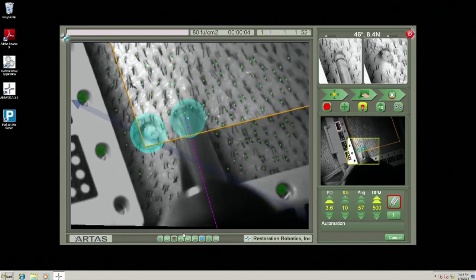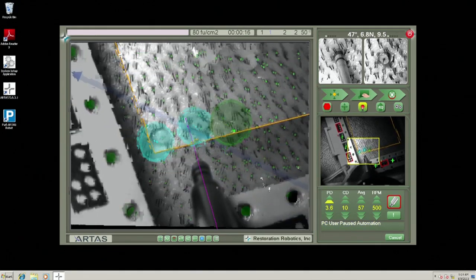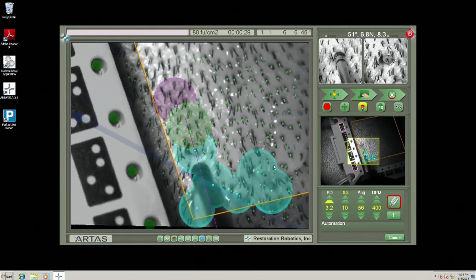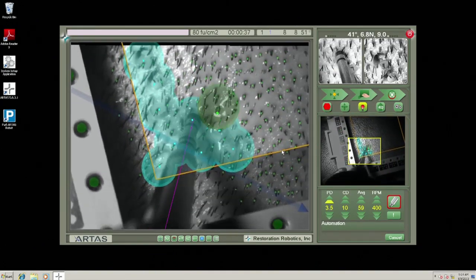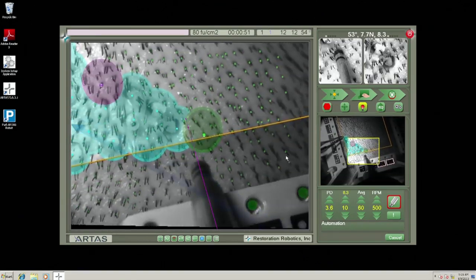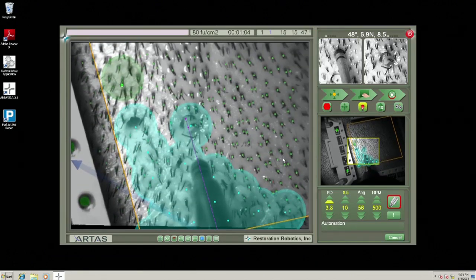It's beginning to harvest. This is great. We are beginning to harvest. I'm going to be changing a few things about my settings, just the diameters of the different harvest attempts. We have a lot of different metrics. We'll try to keep most of our discussions basic, but basically what I just did is I increased the size of the harvest grid. Each time you see a turquoise circle, that circle represents where a previous FUE harvest attempt has taken place. The green is the next harvest attempt that's about to be executed, and the purple is the one just in front of it. So you have a real-time assessment of what's going on, as well as what's been previously attempted. Now you can modify the width or diameter of that circle, and make this dissection process or the harvesting process more aggressive or less aggressive.